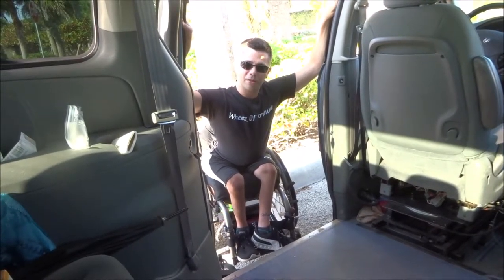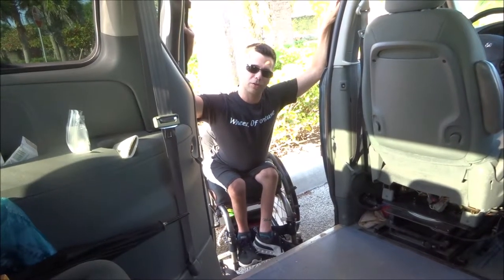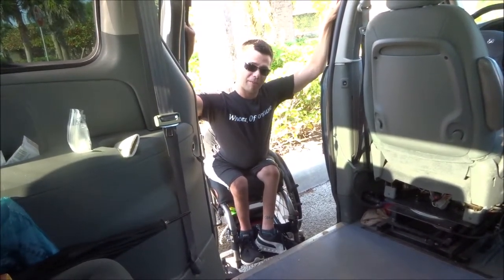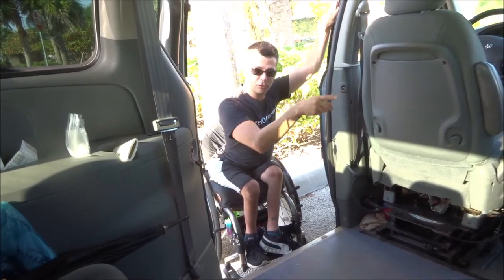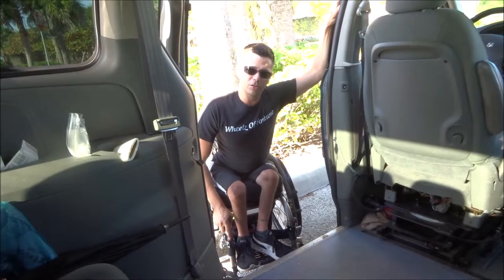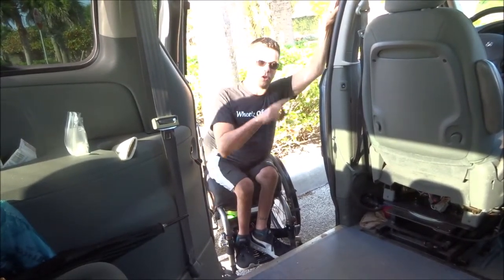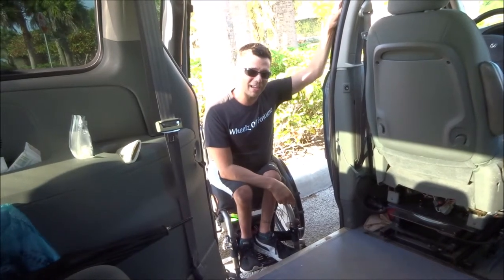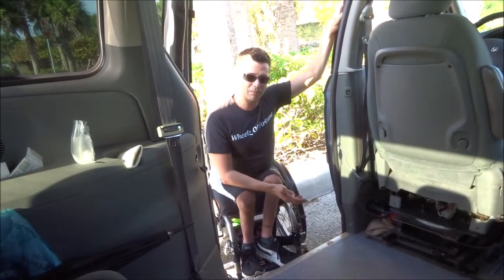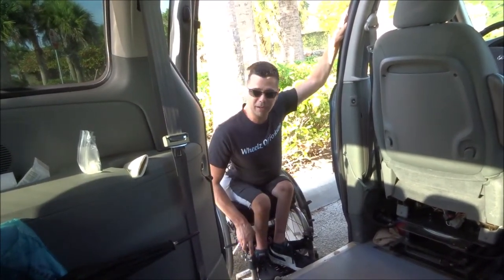Hey again, YouTubers. This is the companion video to the original 'getting out of my ramp van if I am unable to via the ramp on that side.' So in this video, I'm going to show how I get into my van if I am unable to use the ramp on that side. And I have had to do this before — this isn't just something I'm demonstrating for kicks. This is actually a useful skill for me.